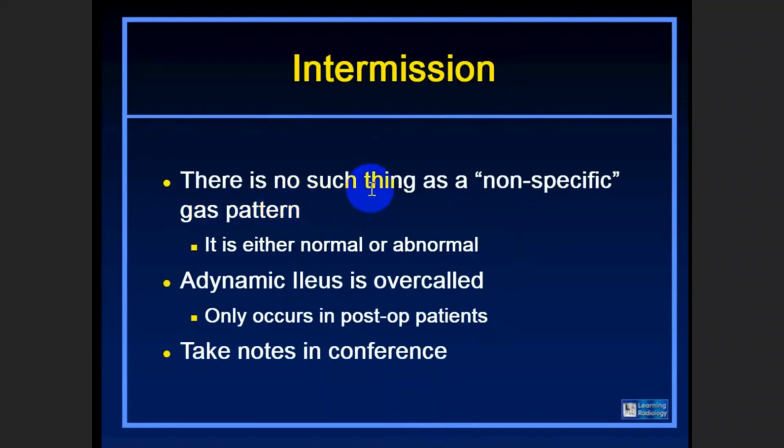Remember, there is no such thing as a non-specific gas pattern. It is either normal or abnormal, always. Adynamic ileus is overcalled sometimes; it only occurs in post-operative patients, which is the generalized ileus type. Take note from this lecture.